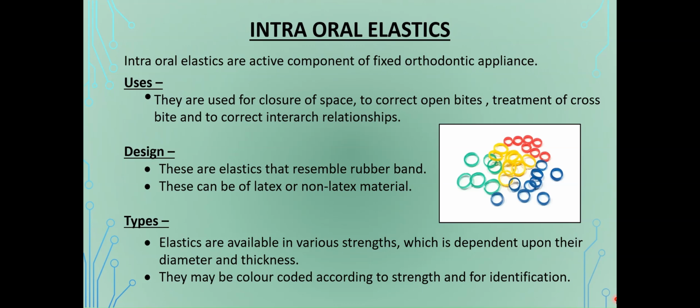Let's get to know about the intraoral elastics. Intraoral elastics are active component of fixed orthodontic appliance. Uses, They are used for closure of space to correct open bites, treatment of crossbite, and to correct interarch relationships.